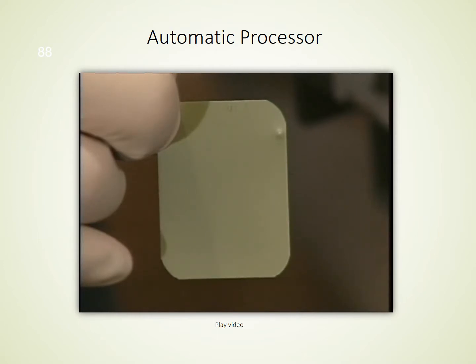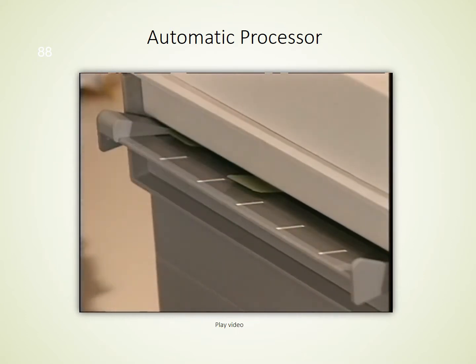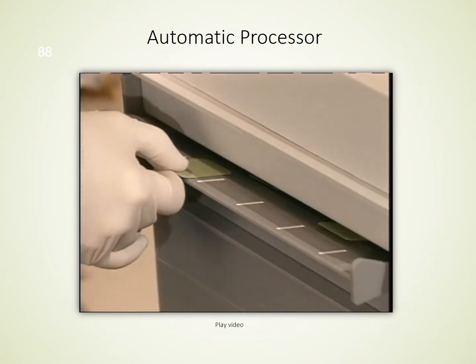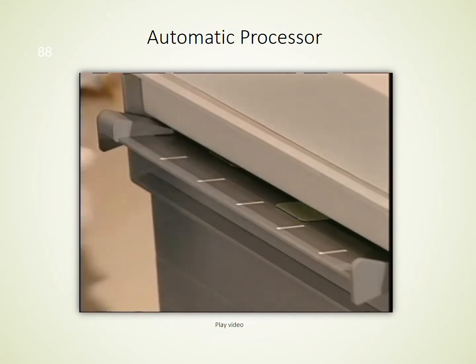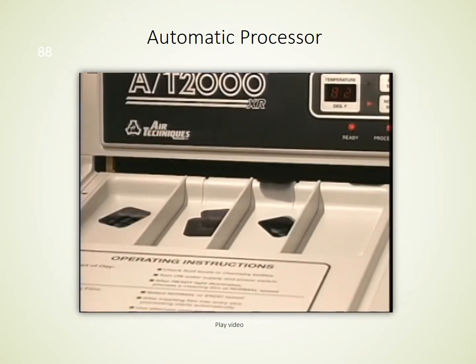When processing intraoral films, insert them lengthwise and straight with the marker point entering last. To prevent overlapping, start with tracks 1, 3, 5. Then use 2, 4, 6. The films are processed and then exit in the same sequence.